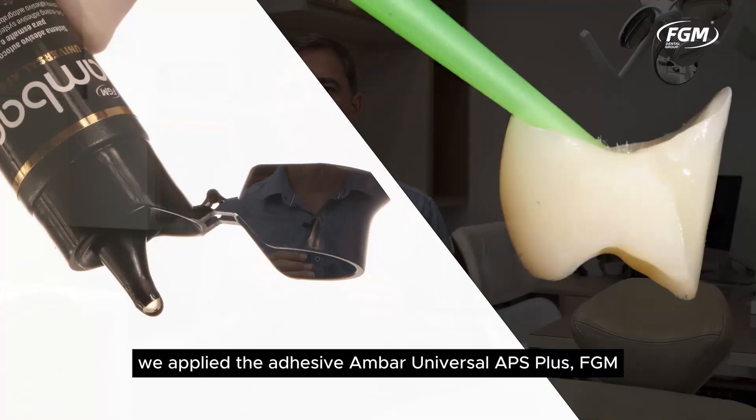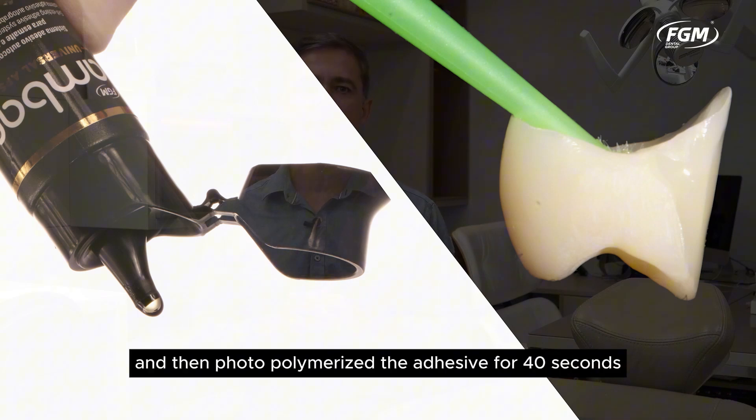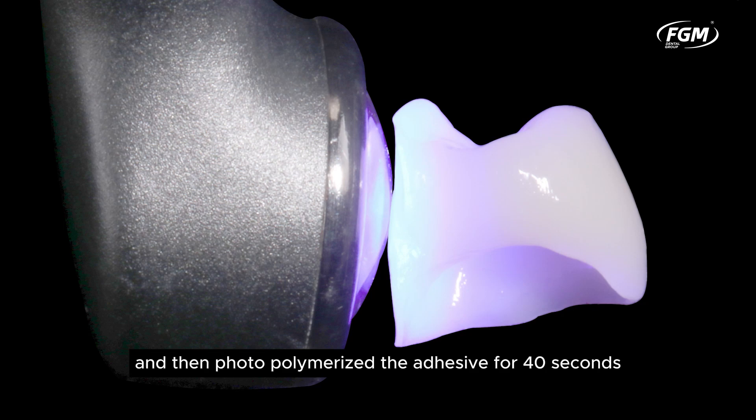We applied the Ambar Universal APS Plus adhesive by FGM on the previously silanized surfaces and then photopolymerized the adhesive for 40 seconds.